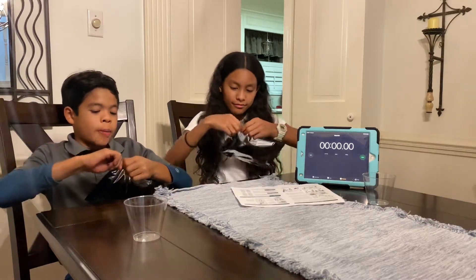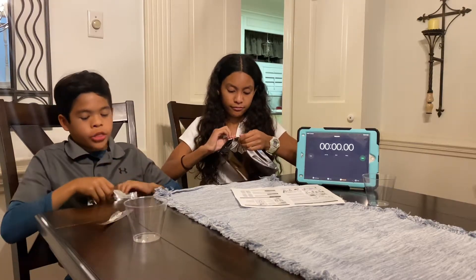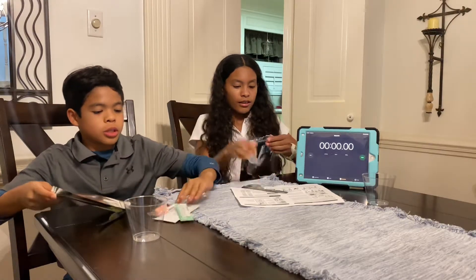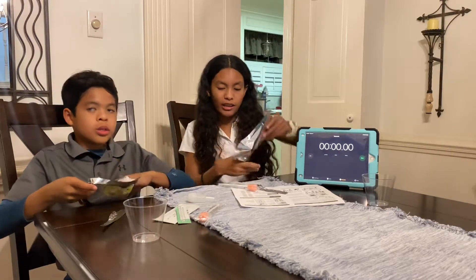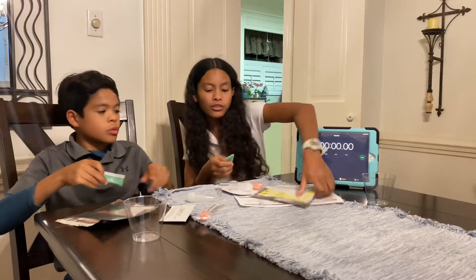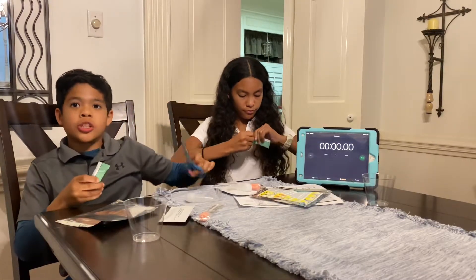First we will begin with opening the package. You might need scissors to open this. Just to let you know, you should not eat or drink anything 30 minutes prior to doing this test.